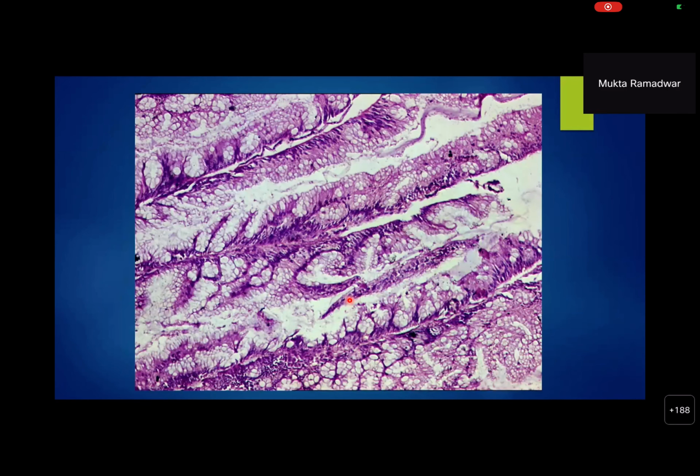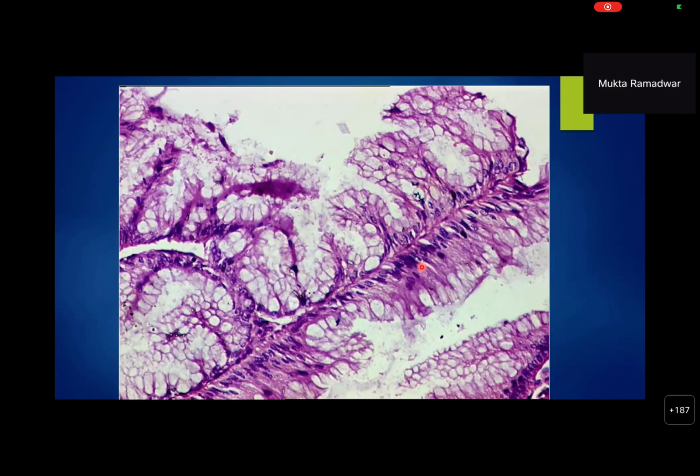So this image, Shreyans, what is it showing? Ma'am, it is showing glands, elongated crypts with maintained polarity. Normal nucleus is seen, and there is an abundant amount of mucin in between. Correct. And then infoldings in form of serrations. So two important points here, which Shreyans had just made. There is no dysplasia, and the tumor is showing serrated morphology, right? There are basally located nuclei and hypermature cells with abundant mucin. Yes. And now it's actually looking like two boots.